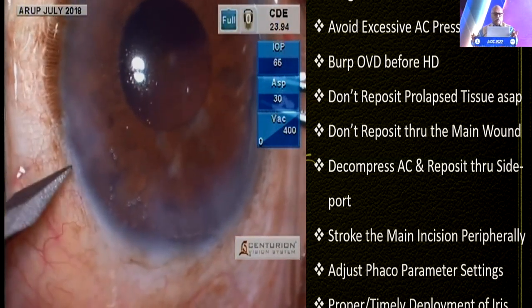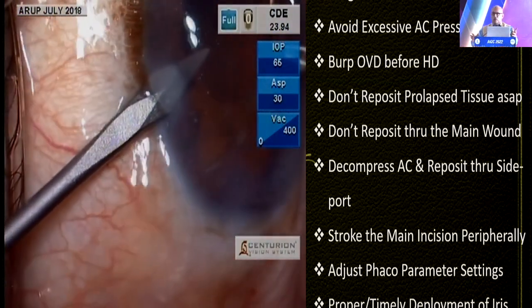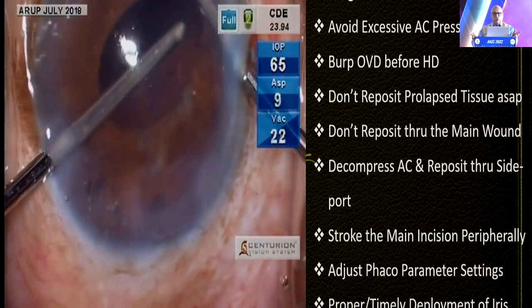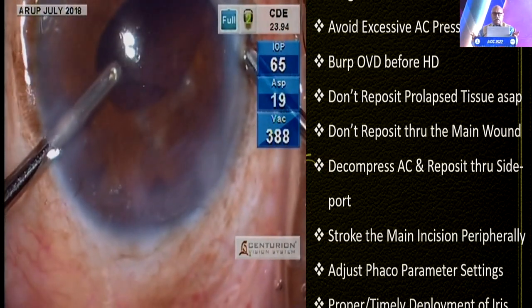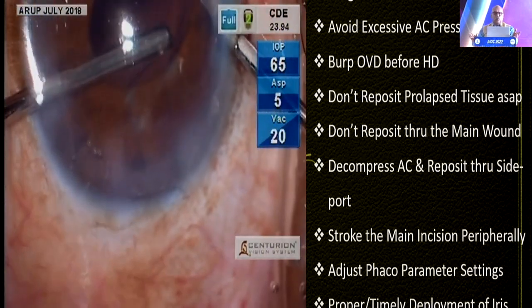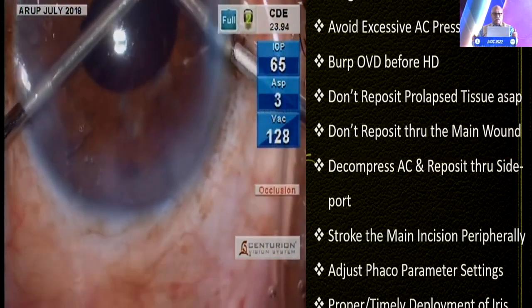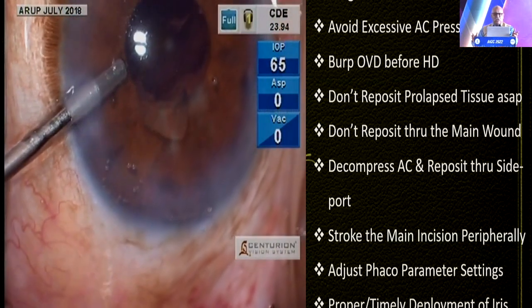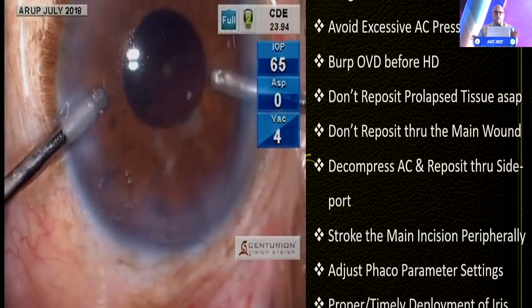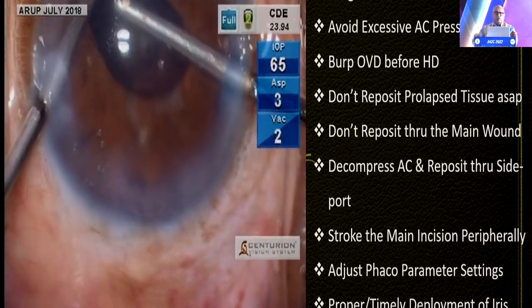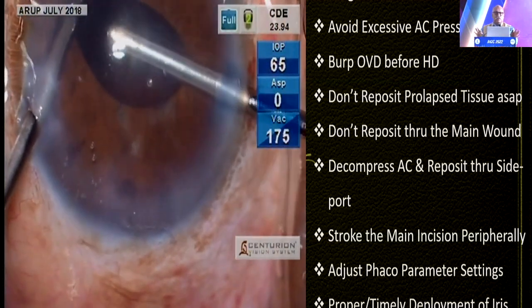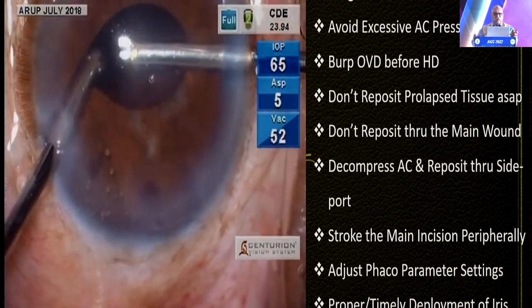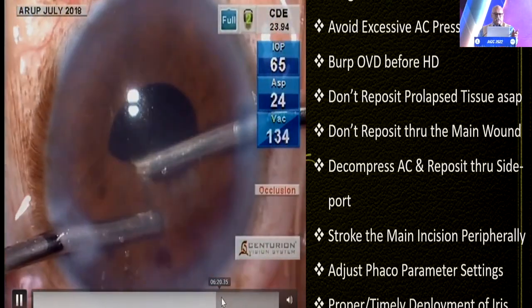The pupil has come down further. I am using a bimanual irrigation-aspiration here, so the superior paracentesis is enlarged. At this juncture, if one feels one needs to use a pupillary device — an iris hook or a ring device — one could definitely go ahead. There is no need to prove you can manage without a device. I have been a phaco surgeon for more than three decades and managed cortex removal successfully here. If engaging an iris hook at this juncture, make sure the device does not hook around the rhexis margin; inject a good amount of OVD creating space between the pupillary margin and anterior capsule before engaging the device. Cortex removal was more or less successfully done.